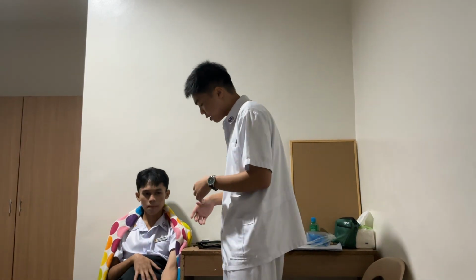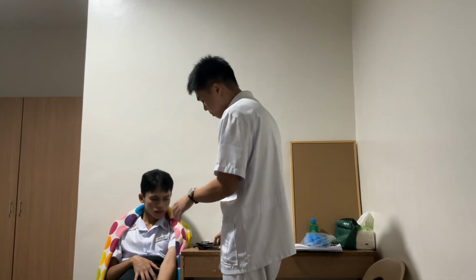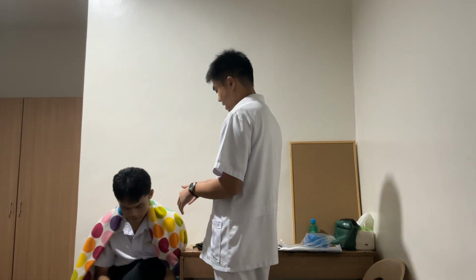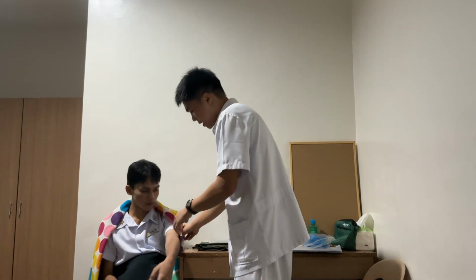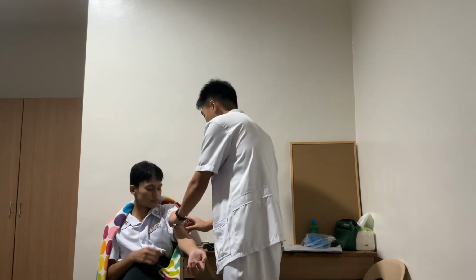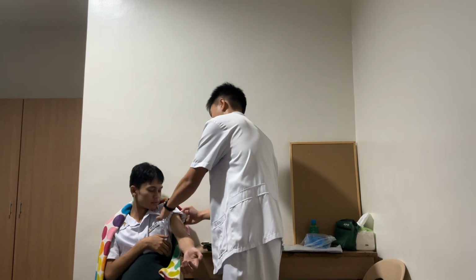Okay, so ma'am, I'll be taking your blood pressure on your left arm. Okay, so feet flat on the floor, and then straight. Then after that, the elbow will be slightly flexed. So ma'am, I'll flex again, the same, on the floor. So it will be exposed, and then I'm going to fold your sleeve to expose the area.